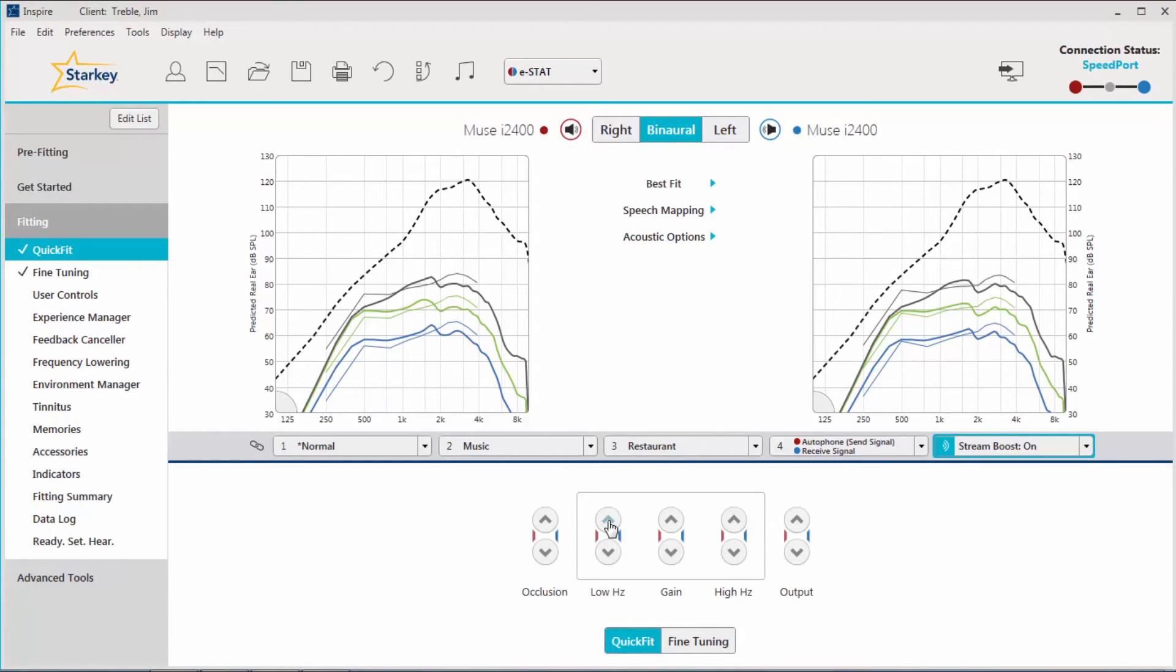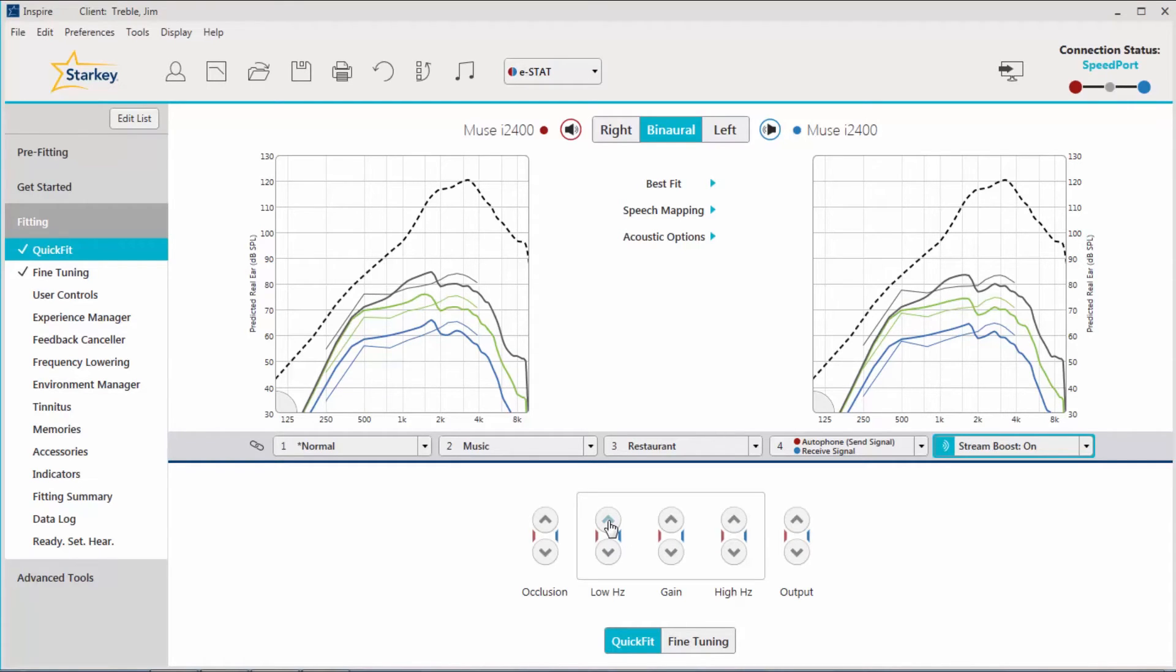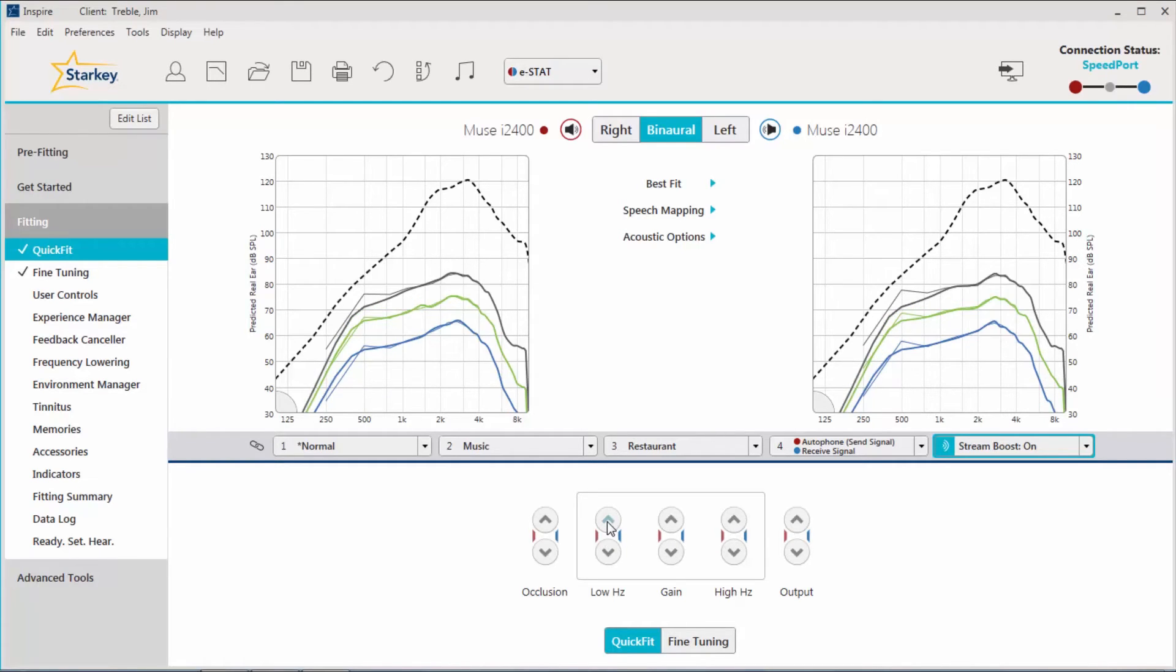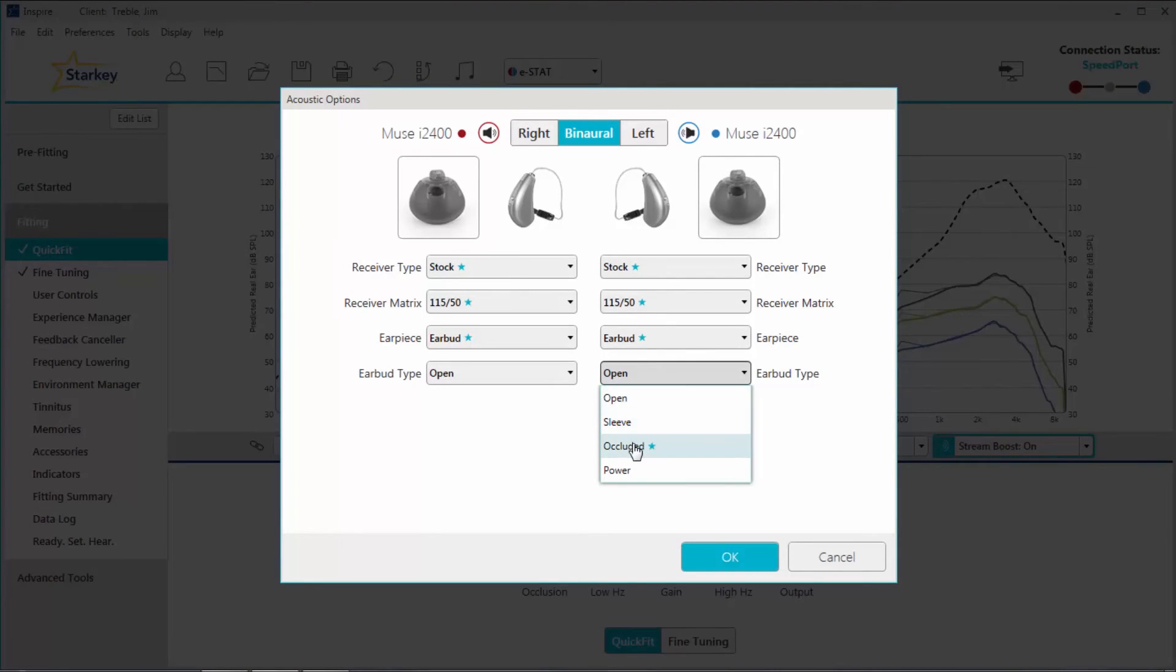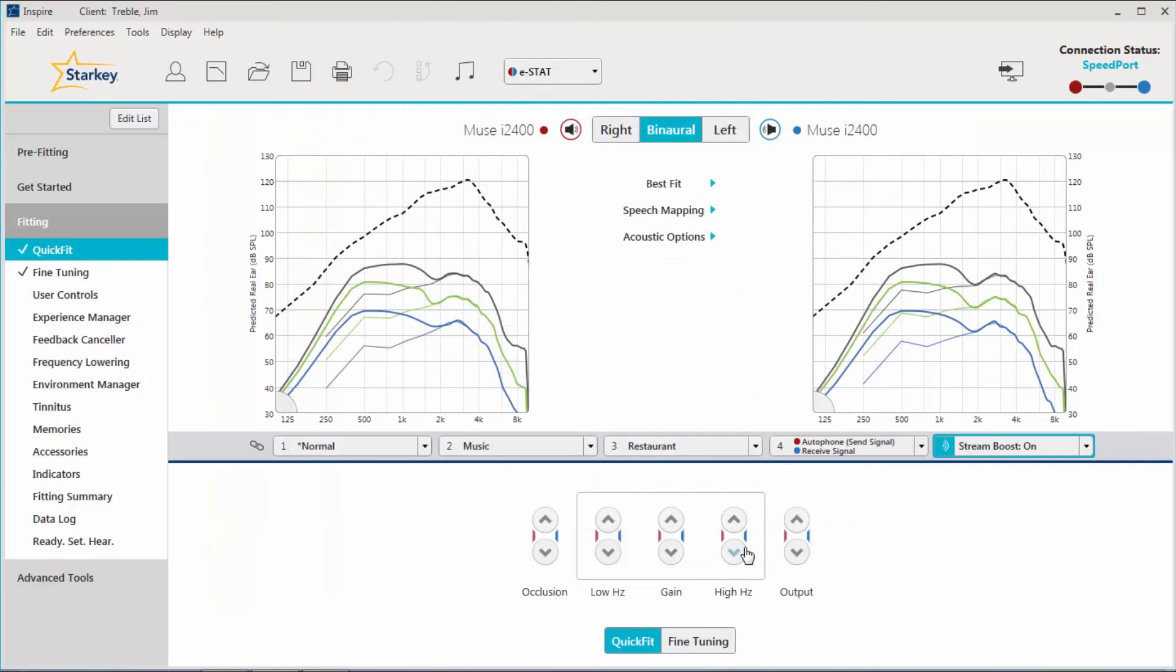If neither of these approaches is successful, sound quality issues may be solved by changing from open earbuds to occluded earbuds. It is simple to change the earbuds style and see how the patient reacts. It is important to identify this change within Inspire 10 via the Acoustic Options screen. This allows for an accurate display of the hearing aid's frequency response.